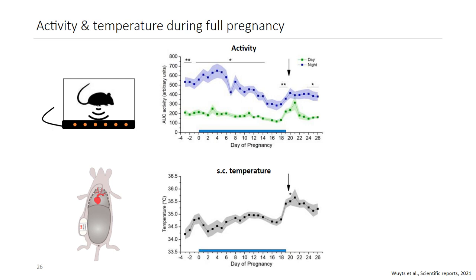So besides that, we can also measure the subcutaneous temperature, and this is being measured inside the transmitter body itself, and that's why we would measure subcutaneous body temperature. And here we observe that at the end of pregnancy, so right after delivery, the temperature increases.